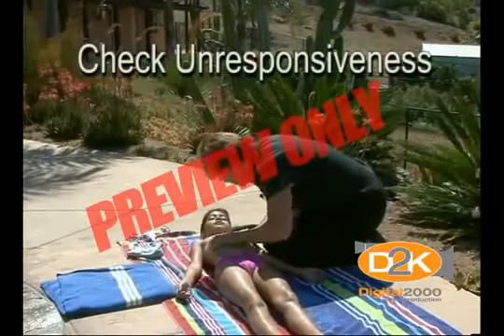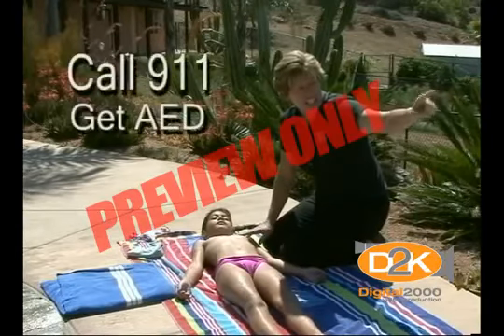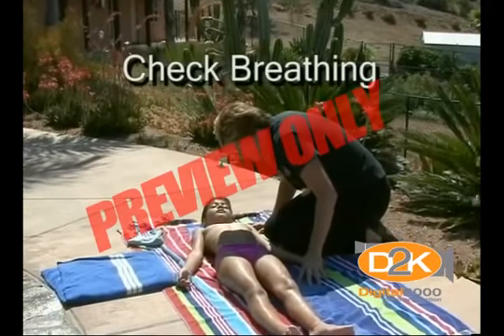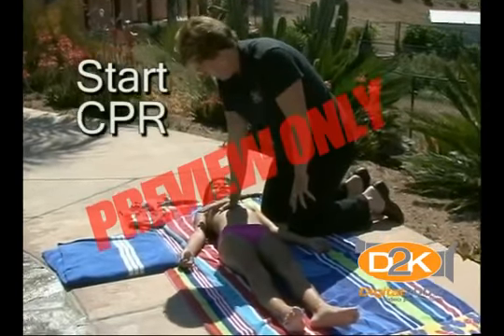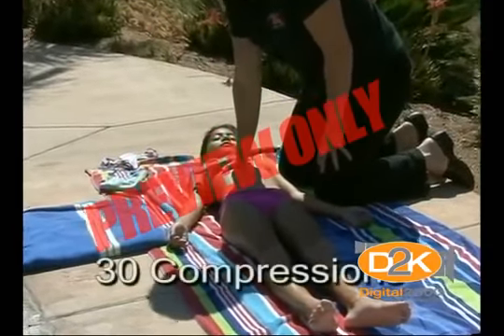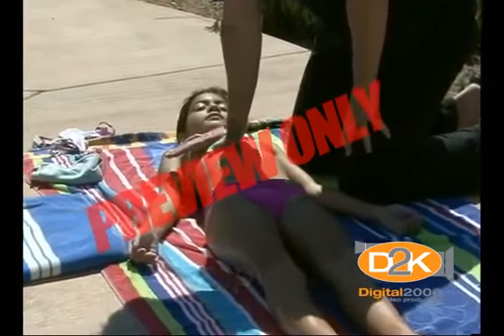Lena, wake up. Are you okay? Lena. Tori, call 911, get the AED, and come back. I'm observing for breathing. Not breathing. 1, 2, 3, 4, 5, 6, 7, 8, 9, 10, 11, 12, 13, 14, 15, 16, 17, 18, 19, 20, 21, 22, 23, 24, 25, 26, 27, 28, 29, 30.